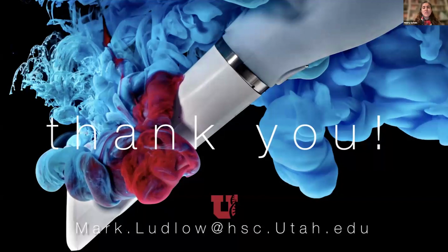Thank you, doctor. This next question is from Dr. Lupe Poussin. Any advice to take the bite in full arch cases? Yeah. So again, the first advice I'd say, like I talked about in there, is make sure you tap, tap, tap, tap. If you're going for full arch, if you've got a full arch of prep, I don't know what you're talking about relative to full arch, whether it's full arch implants, full arch preps of teeth, what you're doing. If you have full arch set of teeth, okay, what I do is I will have my provisionals on the one side, and then I will scan the other side, my bite that way.